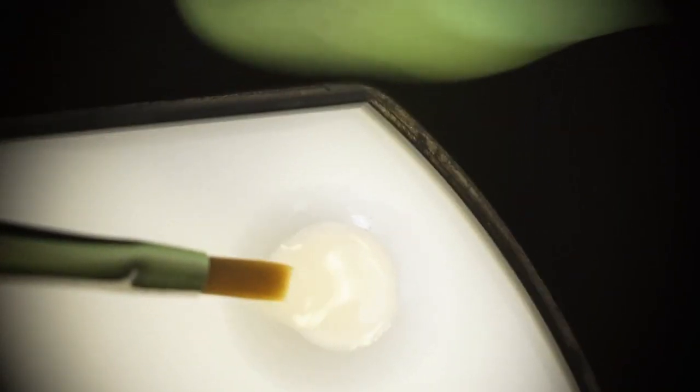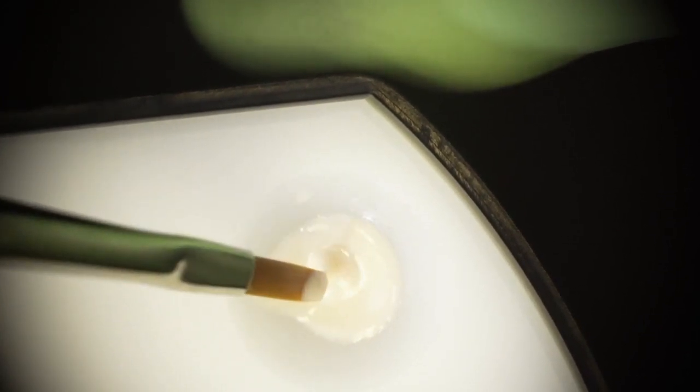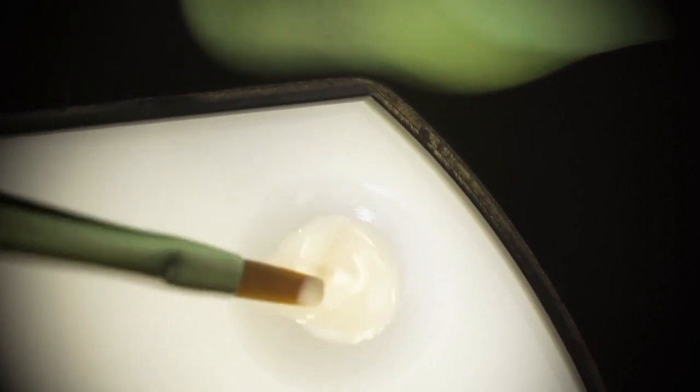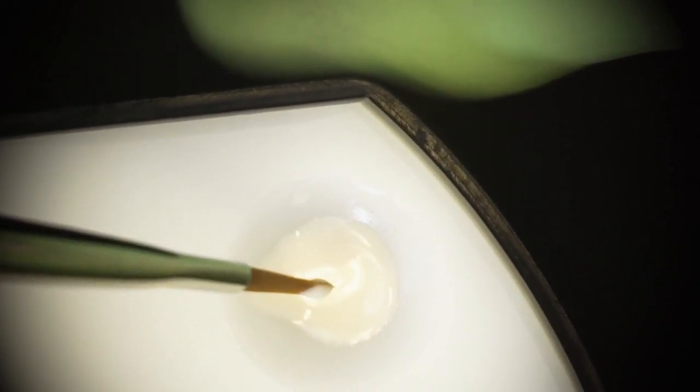So I'm going to go to my pink opaker now, and I can just dip my brush into the pink opaker, and the pink opaker will stay at that tip without wicking up into the brush.